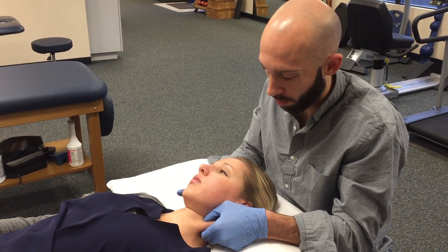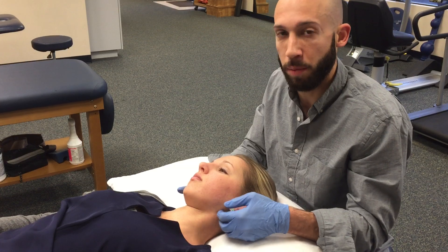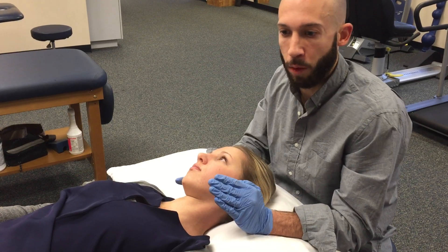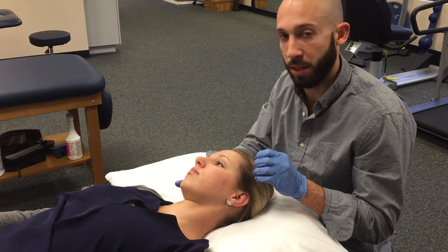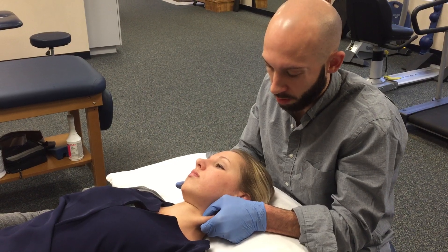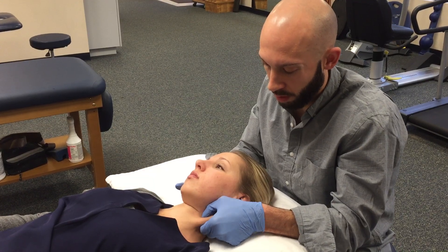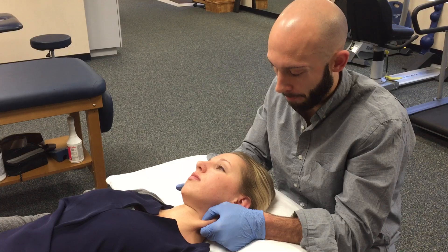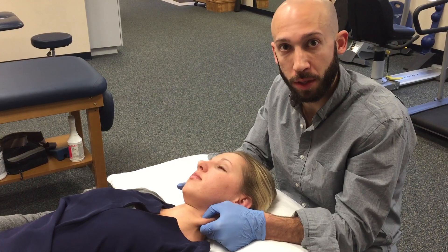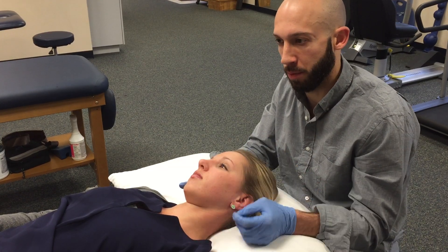There may be multiple trigger points within that taut band, so you want to make sure you palpate the whole length of the muscle. You're trying to identify the most painful trigger point, which ideally reproduces the patient's head symptoms. We identified a trigger point in this taut band of muscle here — it's painful to palpation locally and it's also reproducing her headache symptoms. So that's where we want to go.